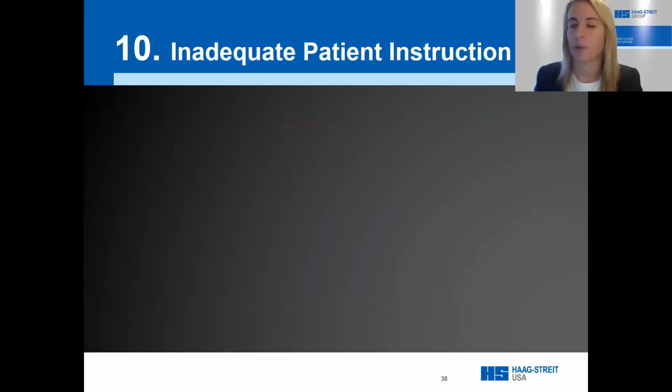We made it, everyone. We're on number 10 of common mistakes when running visual fields. And in my opinion, this is the most important. You can input the correct patient information, put in the correct trial lens, choose the right visual field pattern and strategy, and line the patient up correctly. But if the patient has no idea what they are doing, the results will essentially be unreliable.